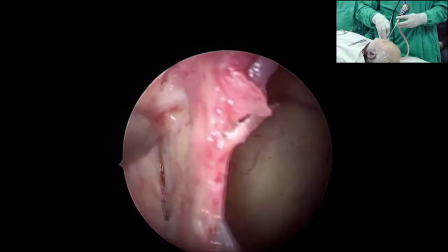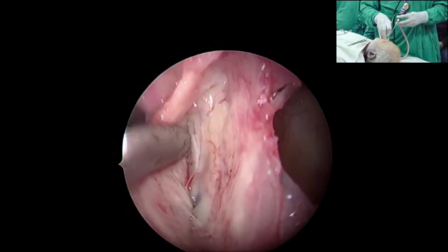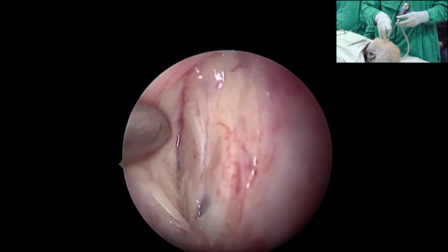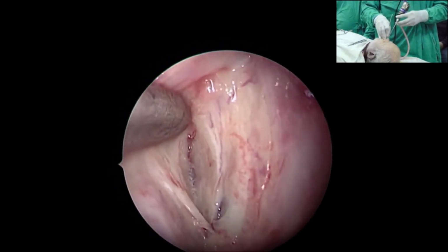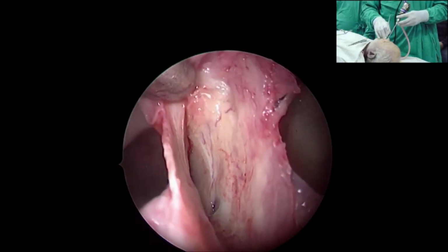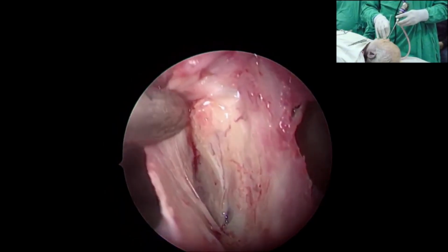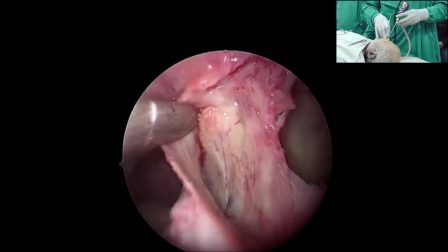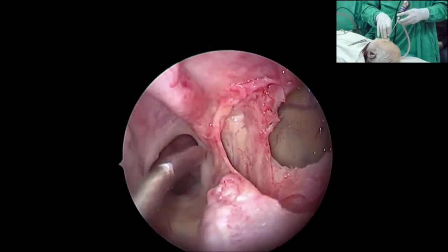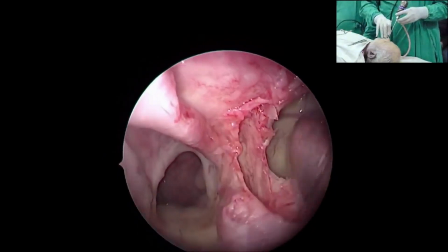And see something coming out from behind the posterior wall of the maxilla. See a lot of nerve fibers which I have severed. Can you see these nerve fibers? Very clearly. These are the posterior nasal nerve fibers coming through this pterygoid bone into this flap. See this? And this crest of the bone, see this crest of the bone? If I punch out this bone, immediately behind that is the sphenopalatine artery.